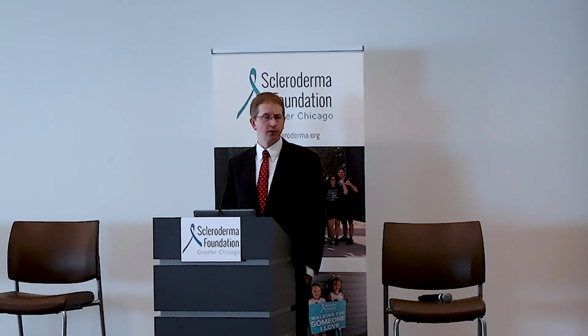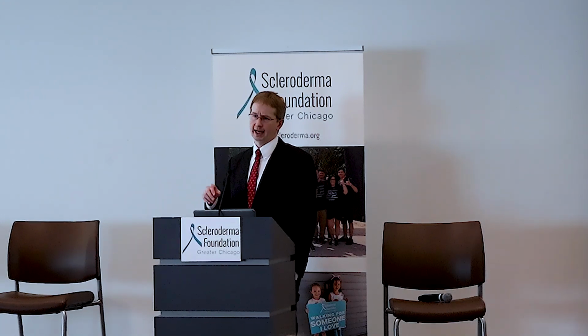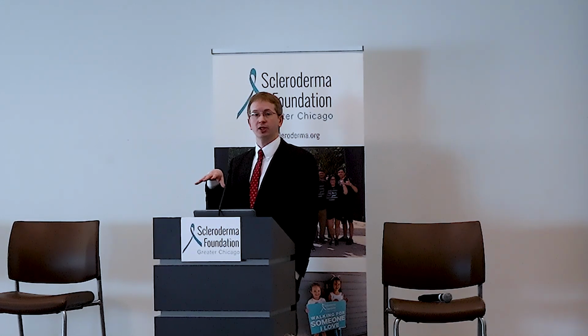Ultrasound guidance can improve our performance of procedures and allow us to do procedures we wouldn't otherwise be able to do blindly by landmarks. And big picture, when we think about using ultrasound to diagnose anything beyond what's going on in the joint, basically beyond what is standardized for use in other rheumatologic diseases, it's a complete blank slate in terms of any degree of standardization with respect to skin thickness or lung ultrasound.